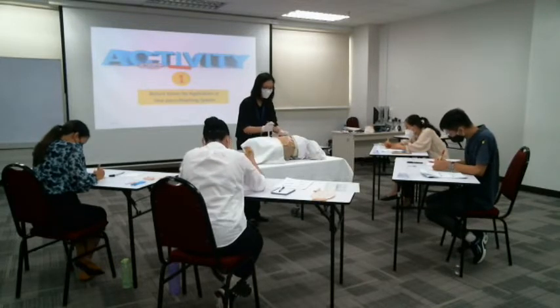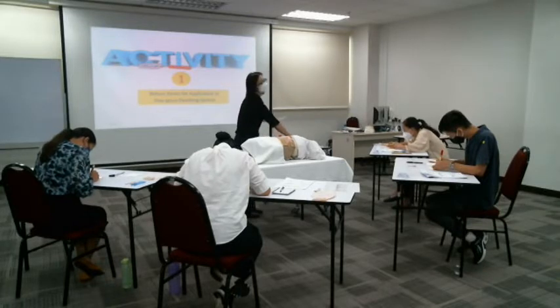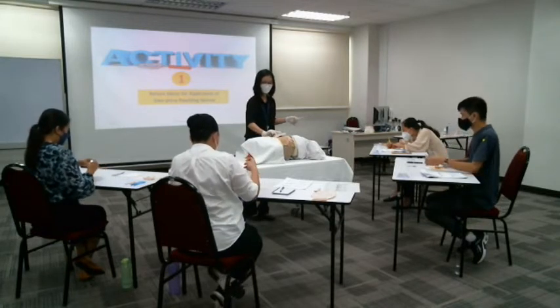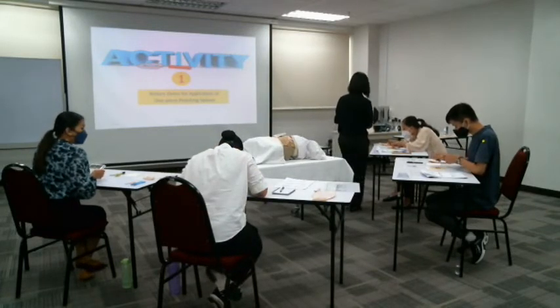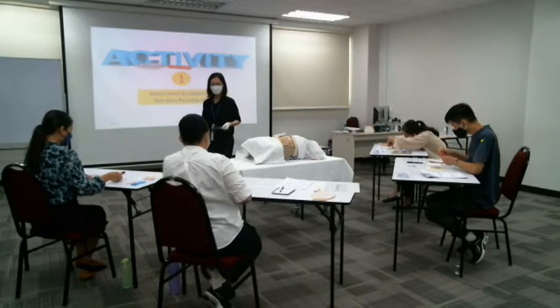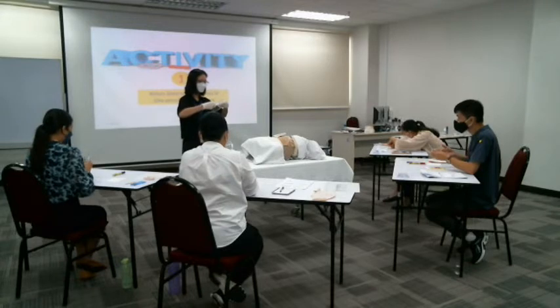So then measure on it and use the marker pen. So you use your marker pen to trace. Okay? Trace, make sure you put the arrow and the date. Okay, next is to cut on the plastic sheet. So you cut the whole, cut the opening that you measured just now.